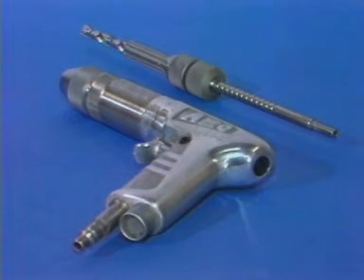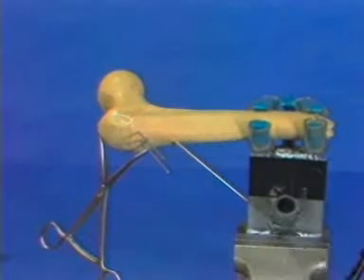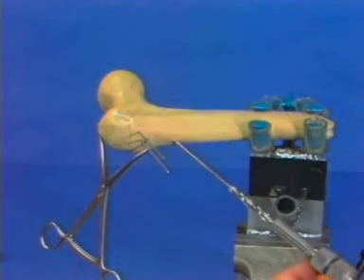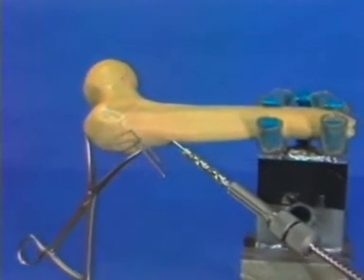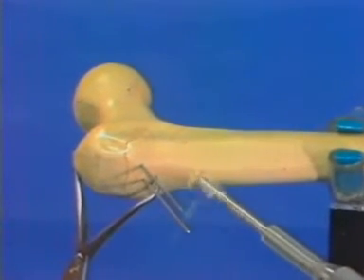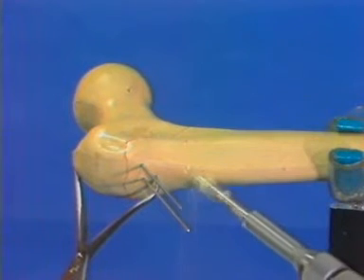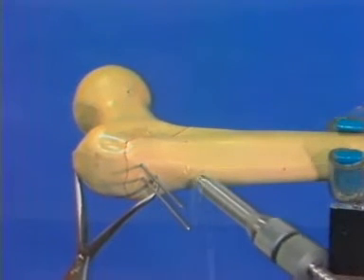We next introduce the triple reamer into the universal drill and place the drill over the guide pin until it contacts the bone. The hole is then drilled to the point of the third stage of the drill bit. The drill should be run at full speed throughout.